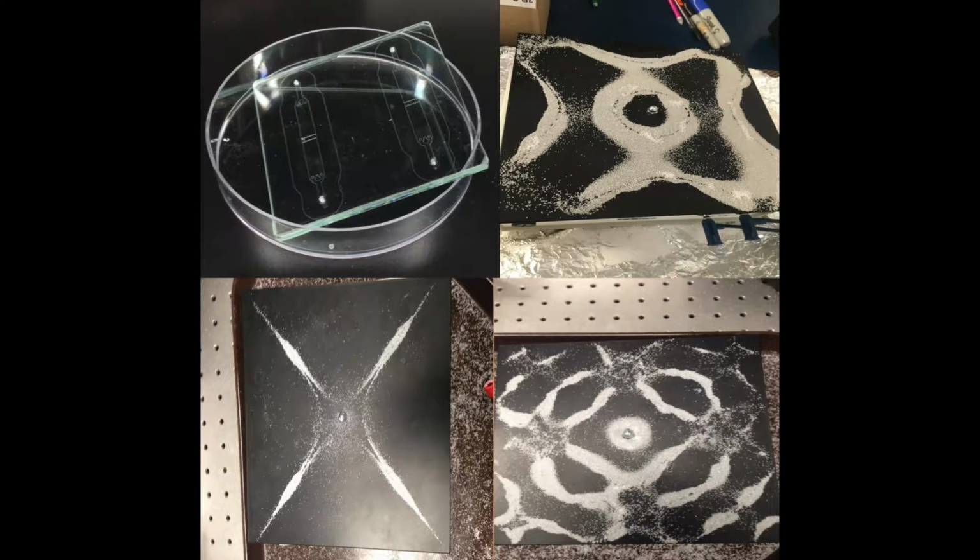We saw a variety of Chladni patterns at a variety of frequencies. As predicted by theoretical analysis, higher frequencies resulted in more complex patterns. We saw differences in the duration and movement of different types of particles, as with the microscale, where tumor and red blood cells act differently.